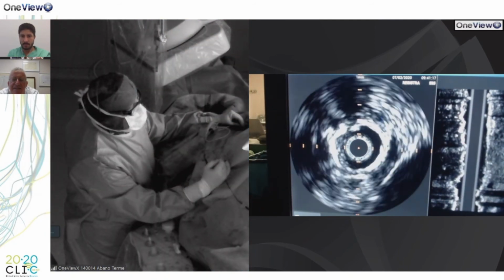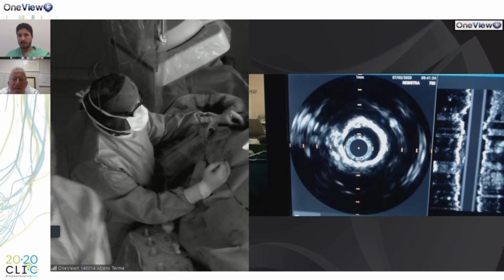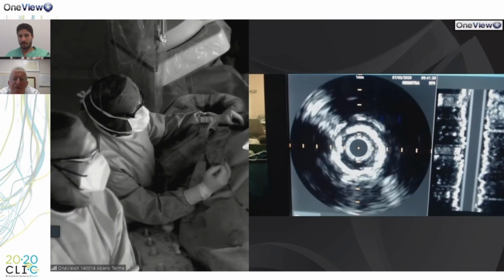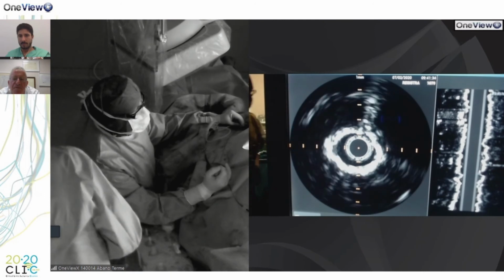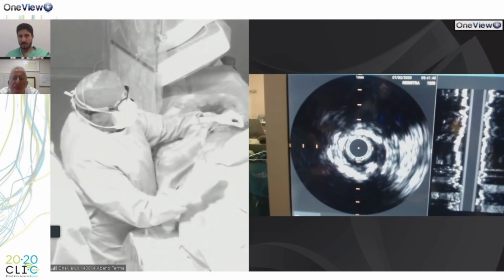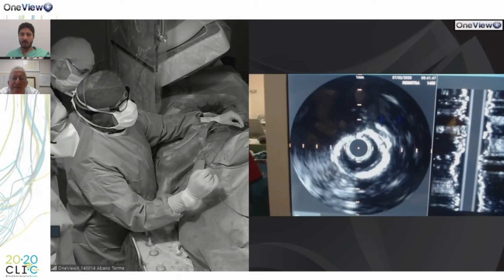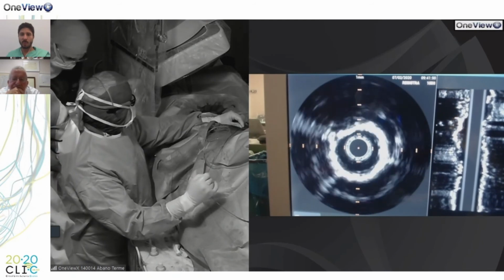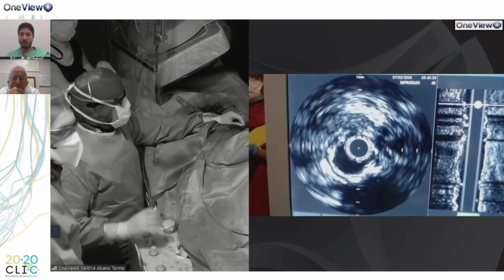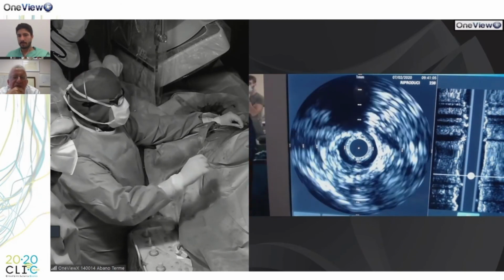Seems to be a quite acceptable lumen gain, because you have a rounded calcium border that is impossible to treat with only the angioplasty. Yeah, I think it's an acceptable result. The lumen gain is for sure acceptable compared to the previous IVUS that was unable to cross the AT. There are some arterial wall defects and too much calcium for sure. But it's impossible to eliminate the calcium.